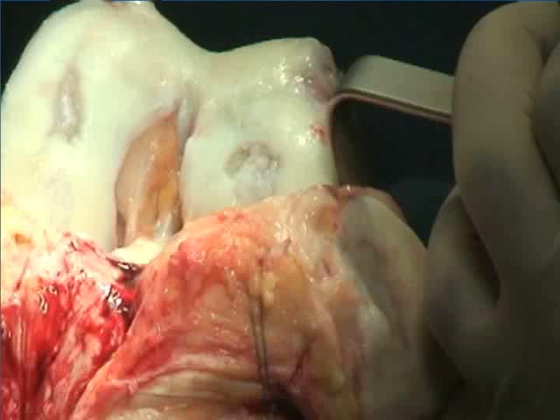In this example, we're using a biologic resurfacing mode in an osteoarticular allograft transplant, but the principles remain the same: chasing down the lesions, extirpating them, and then anatomically resurfacing it. And in this instance, we're using an osteoarticular allograft transplant.